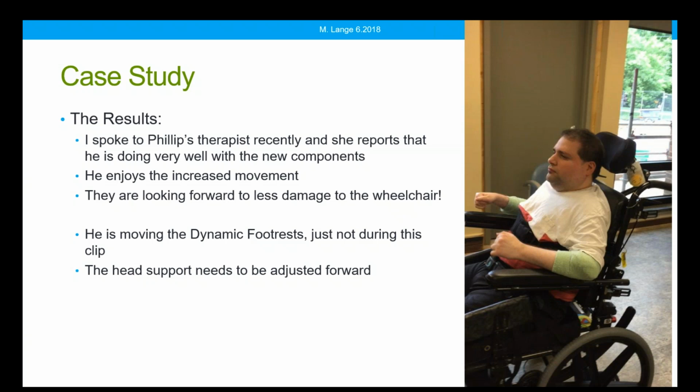Now I'm going to play this video clip in a minute. They just sent this to me, which I really appreciate. In this particular video clip, you'll see he's not moving the dynamic footrest, but his therapist told me he actually moves them quite frequently, just not during this video. Also, the other thing I noticed in this video, and I've already spoken to his therapist, is the pad is a little too far back behind him. So he's not really activating the dynamic headrest hardware in this yet.